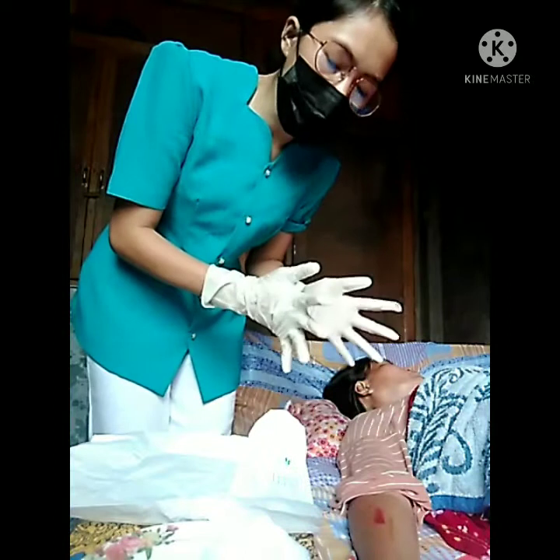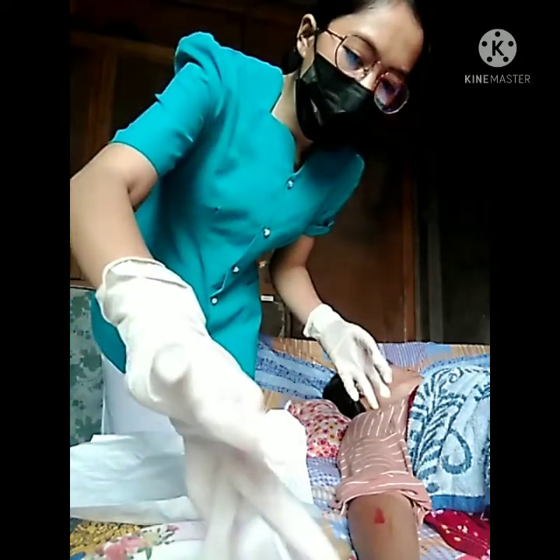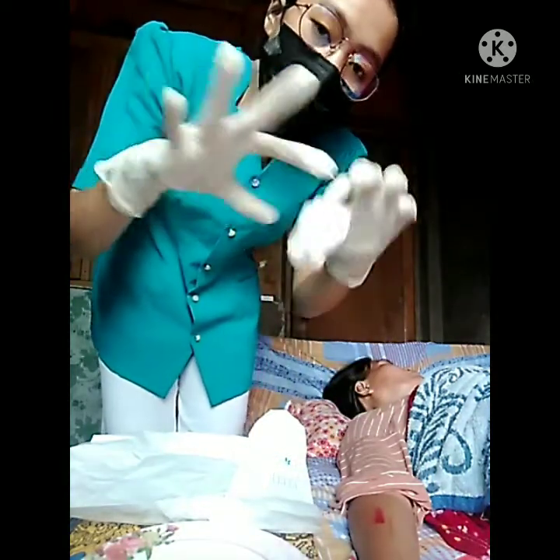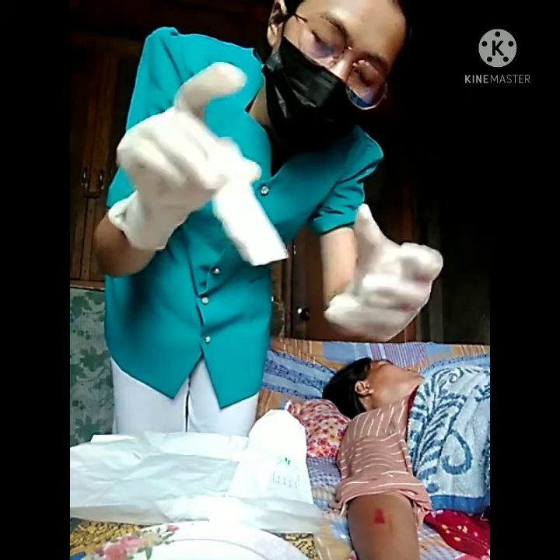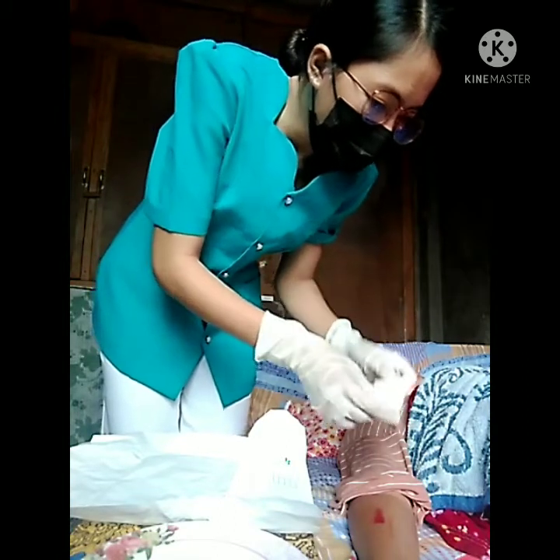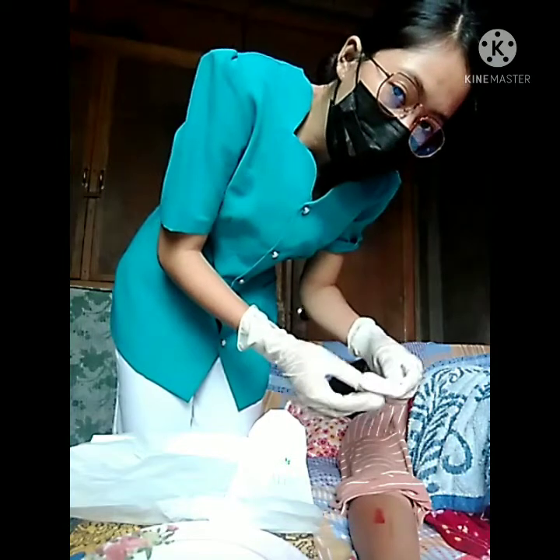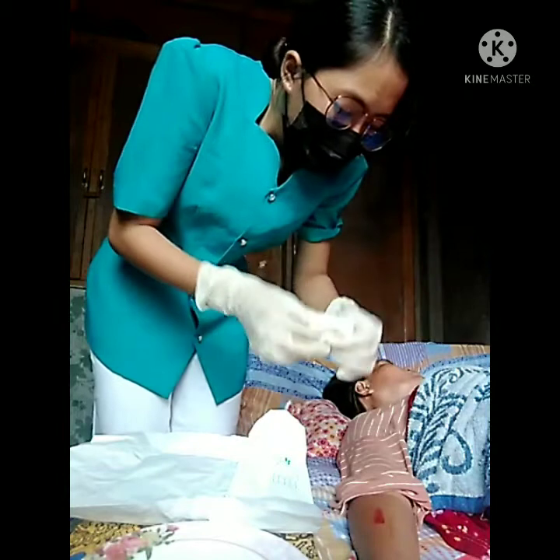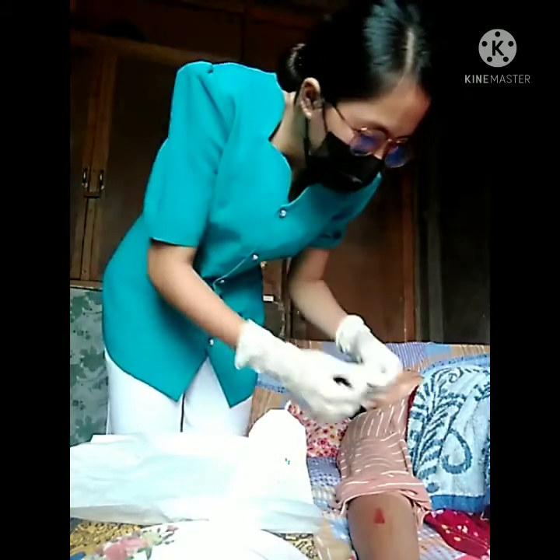So after that, apply moist fine mesh gauze. This moist gauze, wet, as a single layer directly onto the wound surface. I will just fold it because the wound is not so big.